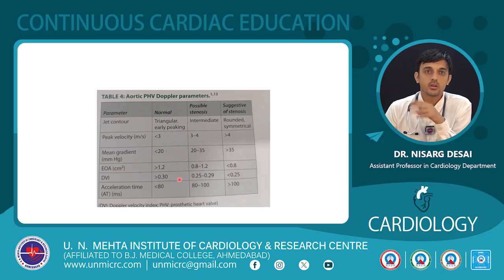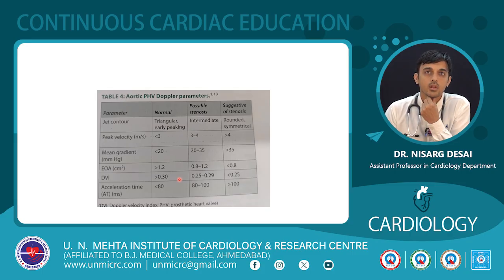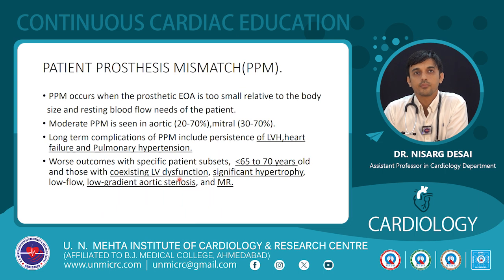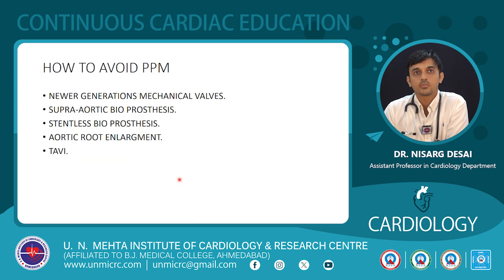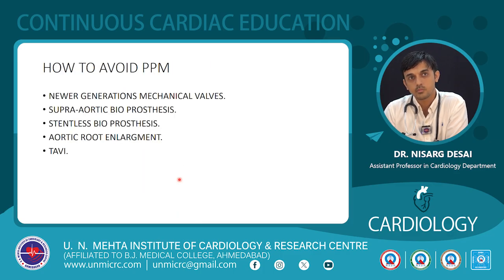However, having studied all of this, there has to be a flow chart to assess how to go about it, starting from clinical, whether to go with cine fluoroscopy directly in a setting where cine fluoroscopy is not easily available. So how should we go about assessing the aortic prosthetic heart valve? We'll come to that, but first we'll study one important aspect, because that will be studied in the flow chart.